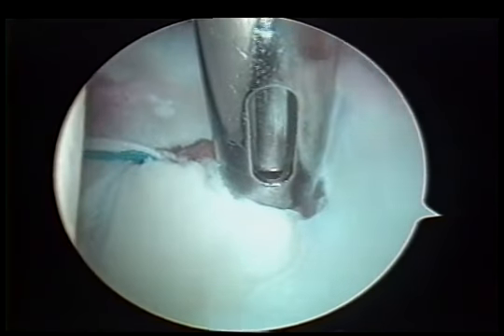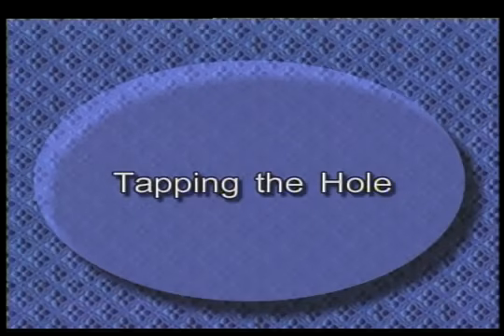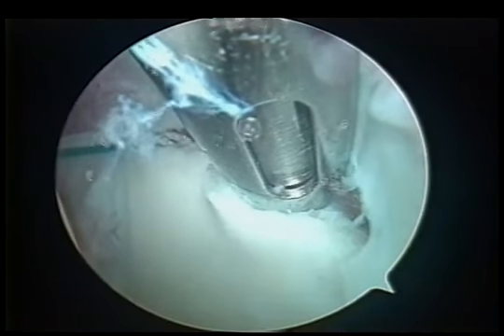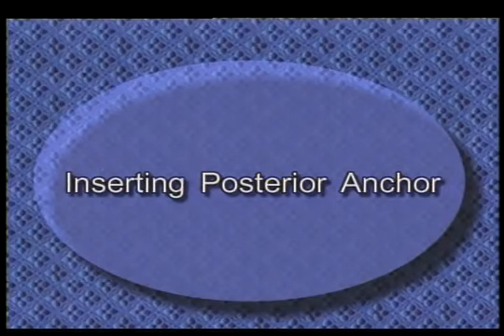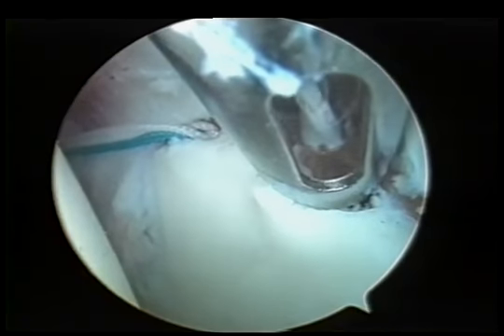We'll use this punch and tap it in up to the shoulder of the punch. Then in that pilot hole we'll place our tap and tap the threads for our anchor. Once again, you want to be angling your spear guide toward the bone so that you're entering into bone. Next we'll place our posterior anchor. There you see the hole.